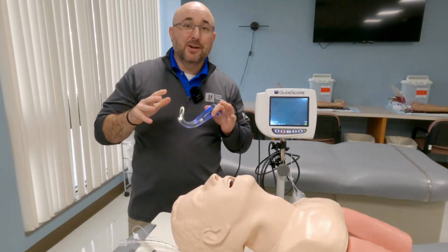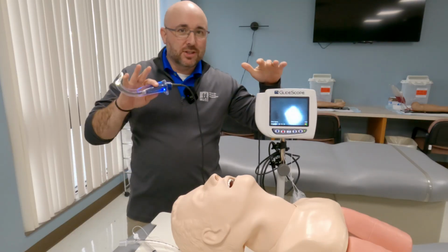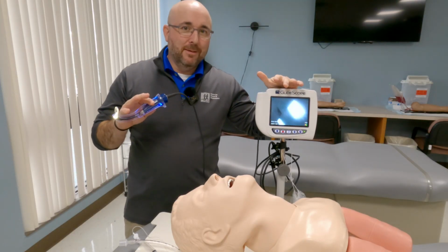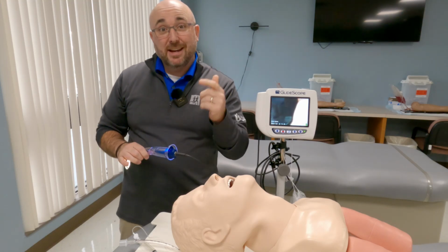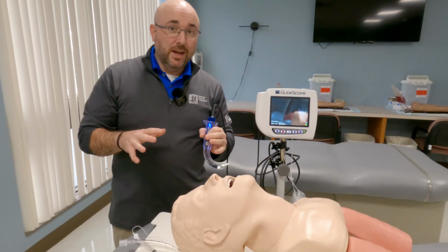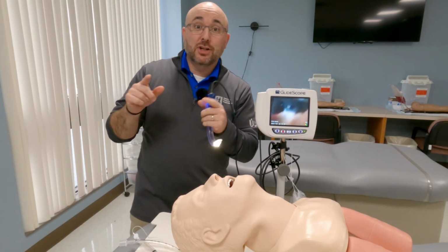I hope this was a good video for you today. Make sure that you're practicing using this. Don't just think you can pick it up and then be able to intubate a patient just because it's video assisted, because there is a different method for viewing and inserting the tube with video assisted laryngoscopy compared to direct laryngoscopy.